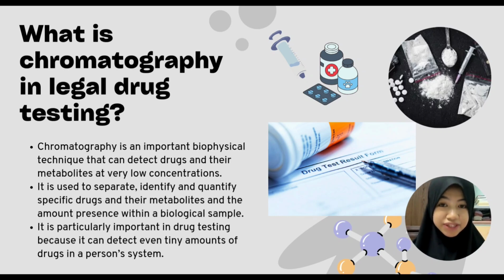Chromatography is an important biophysical technique that can detect drugs and their metabolites at very low concentration. It is used to separate, identify, and quantify specific drugs and their metabolites and the amount present within a biological sample. It is particularly important in drug testing because it can detect even tiny amounts of drugs in a person's system.